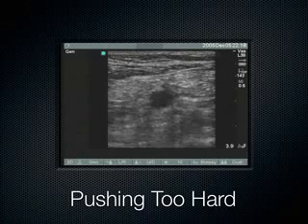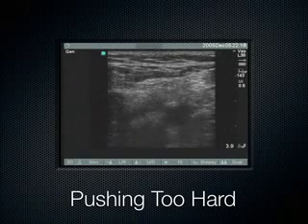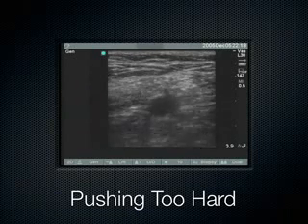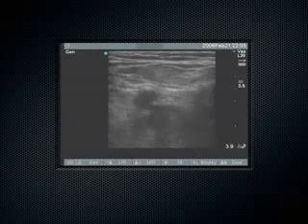So you're staring at this, you're like, where's the vein? Where's the vein? I'm like, whoa, ease up a little bit, man. Pump the brakes. And then you can see the vein pop right open. Okay? So a lot of that is technique. You'll get the hang of that as you move through the rest of your stations today.